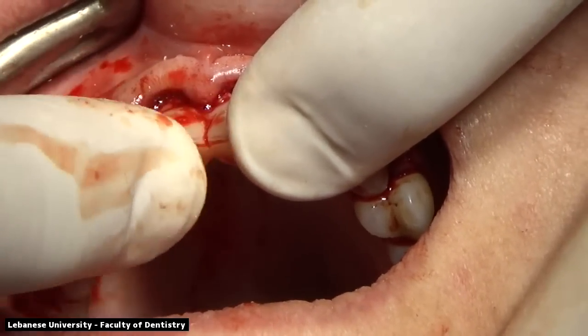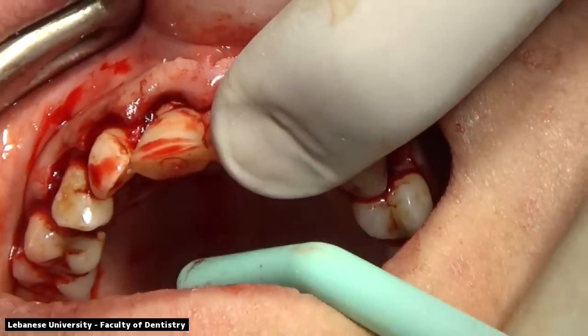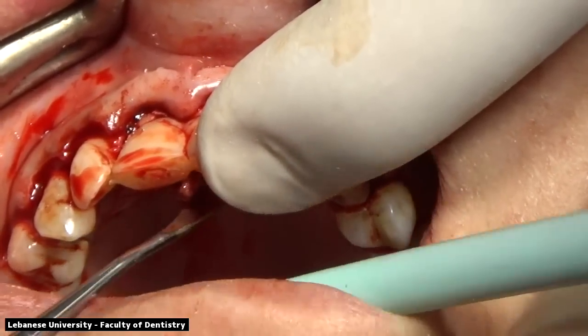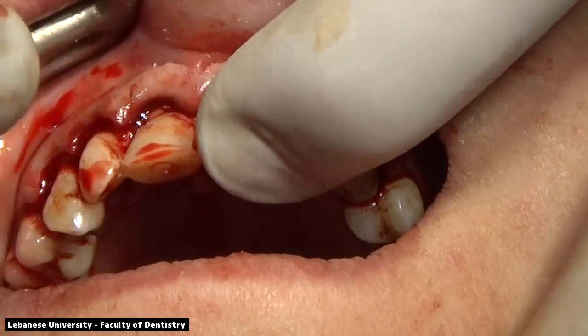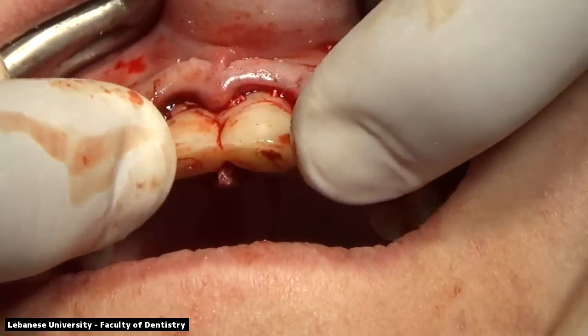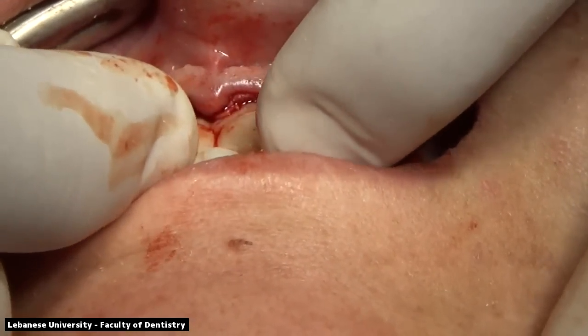We remove it slightly and put it back in so that we don't have any undercuts that might prevent us from removing it after the setting of the material. So we check that there's no undercuts and there's no excess, and that it's easy for us to remove it and place it back. It is a slow setting material, so it will take some time for it to set.